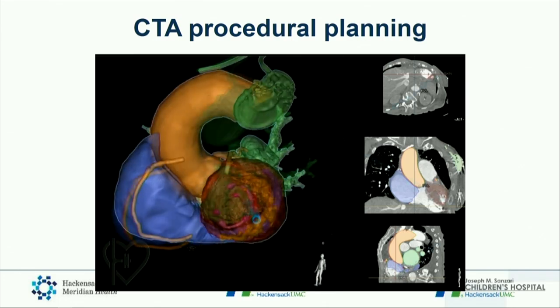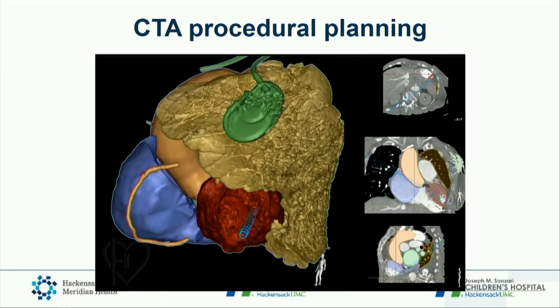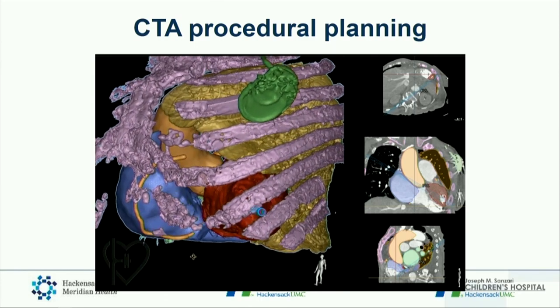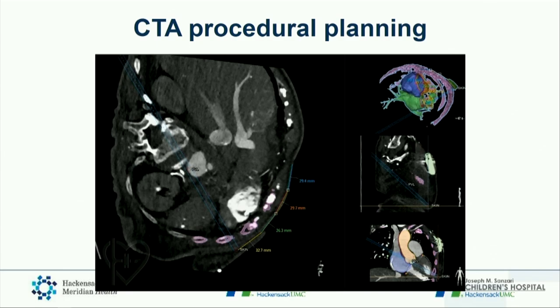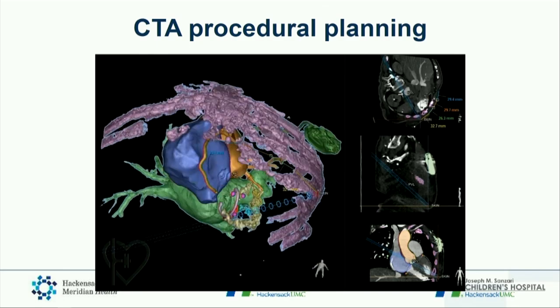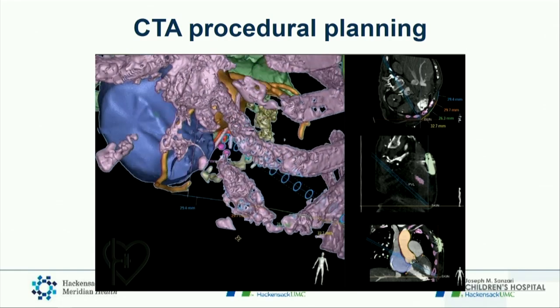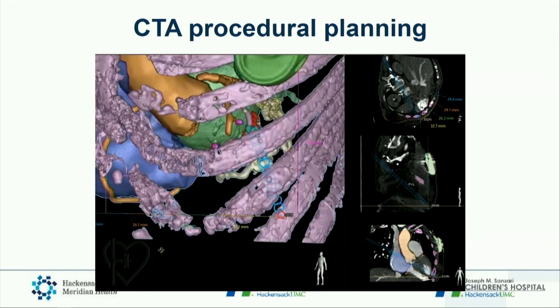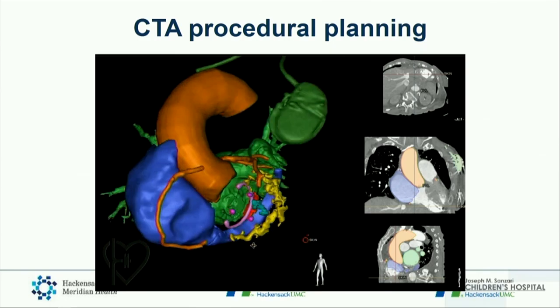This is the process of fusion imaging. We start with a tailored EKG-gated CT acquisition, which needs higher-resolution scanners and appropriate contrast volume and timing. Then you do CT post-processing, using, in this case, Heart Navigator from Philips Healthcare. We do an automated segmentation of the CT data, color-coding various structures through the software, and we can manually correct or add some structures as needed.